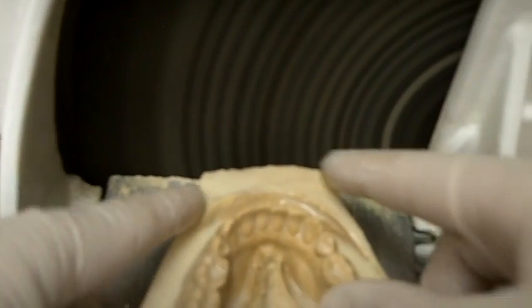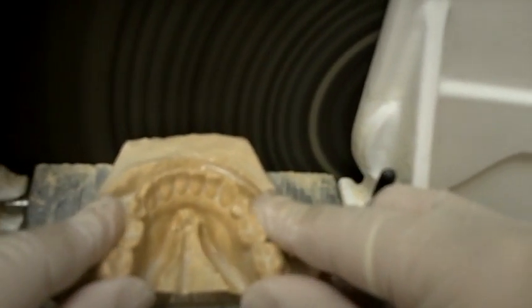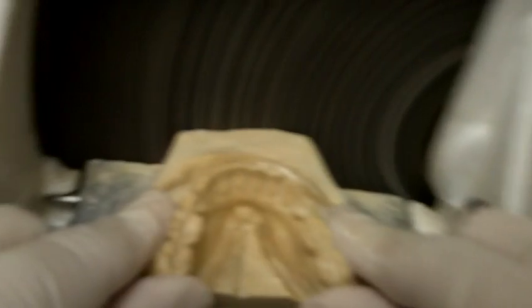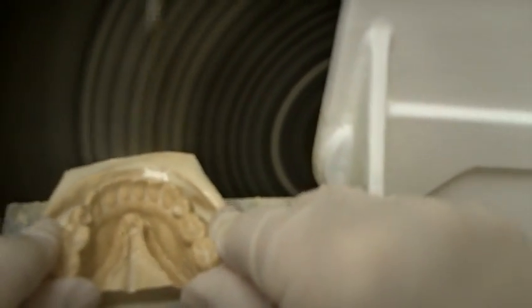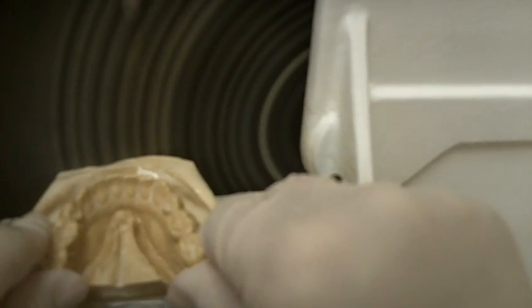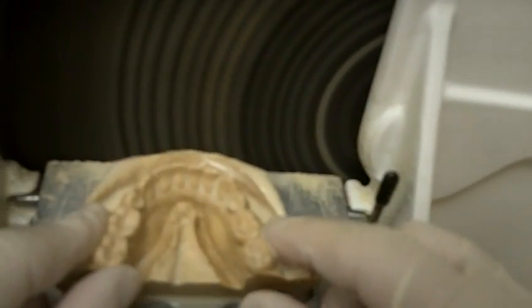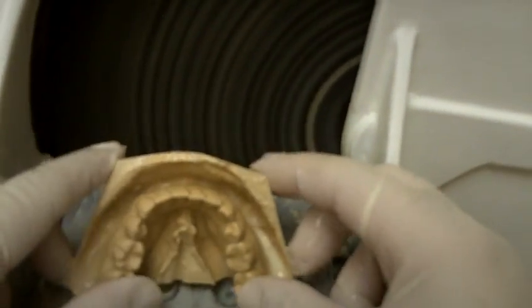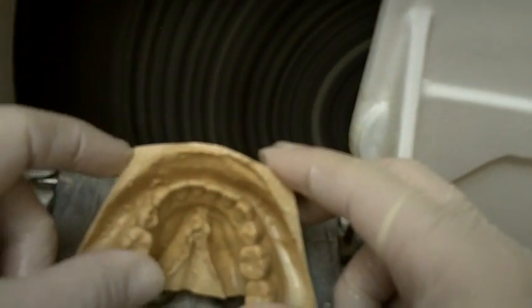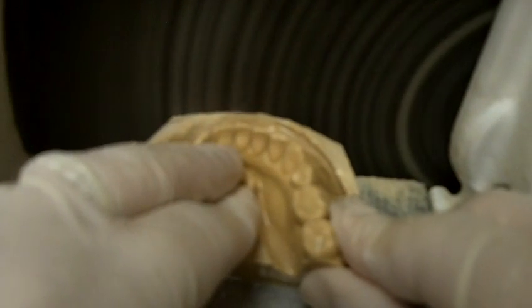Okay, we know it's going to be rounded from here, and we're going to go ahead and use the canine premolar because one is missing. So we'll push down, and then we'll start to go down. So this is important because this is where you want to make sure, and let's wet it a little bit. This is where you want to make sure that your points are going to line up here. As you can see, this one is still a little out.